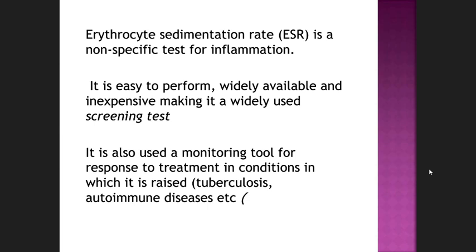Anticoagulated. Yeah, EDTA. Yeah, that's true. So that is the basic thing. First of all, when you draw the sample from the patient, we have tubes with anticoagulant also. There are two tubes, EDTA and citrate. And of course, one is the sterile tube when we take for the serum.